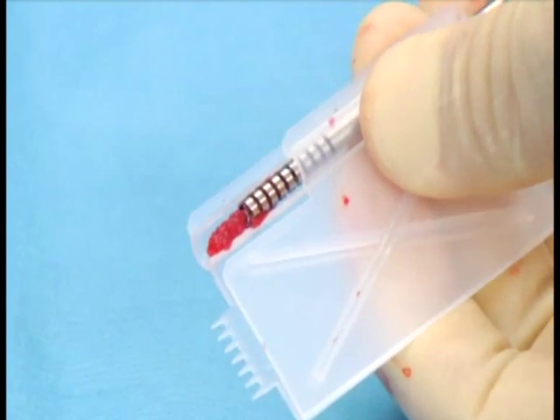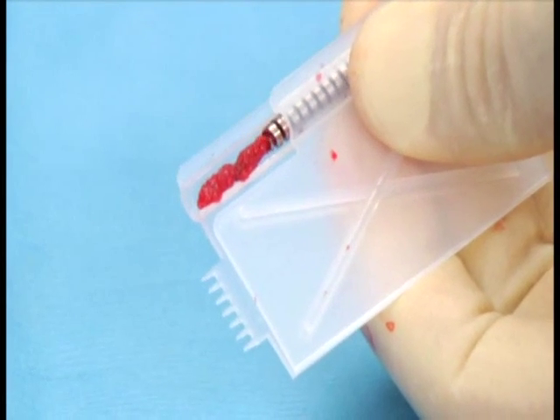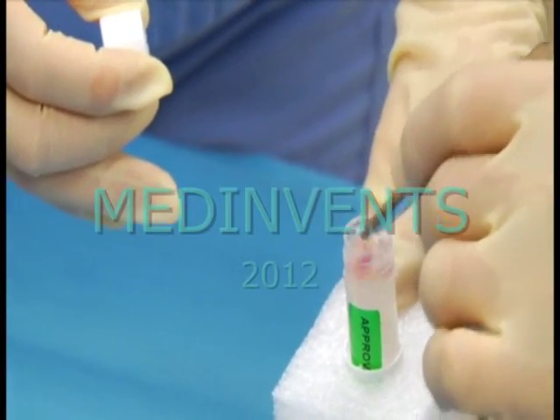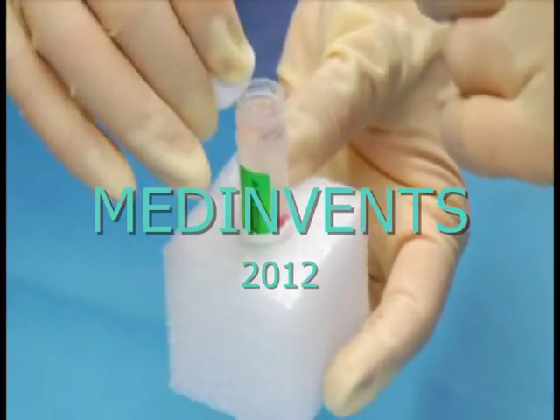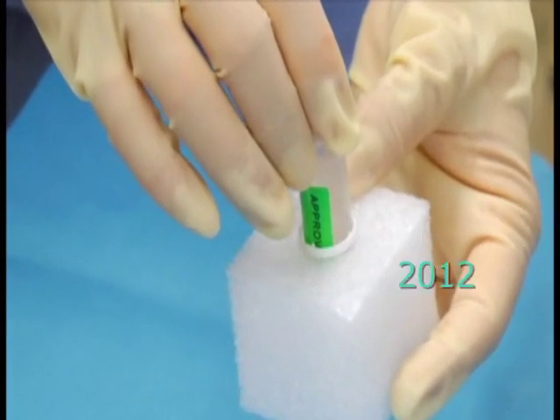Visually inspect the biopsy for quality and purity. Avoid fat and fascia or any white shiny tissue. Next, open the biopsy medium vial, using proper aseptic technique when opening it.